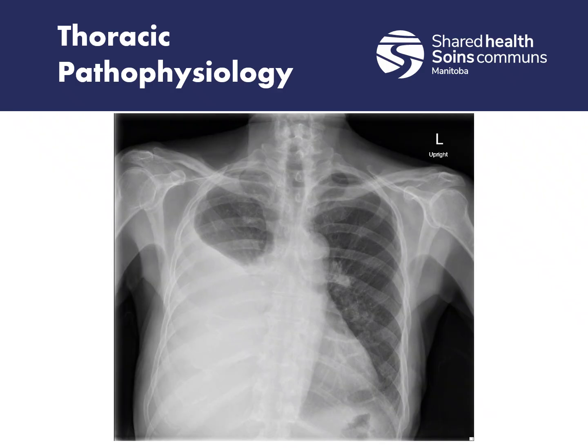With this one, this x-ray and ultrasound revealed a large right pleural effusion. As you can see, that large wide area on the right is obviously not normal compared to a normal chest x-ray. That is about 2.5 liters of fluid in this patient's chest. This patient will need this drained, so they're probably going to get a chest tube to do that.